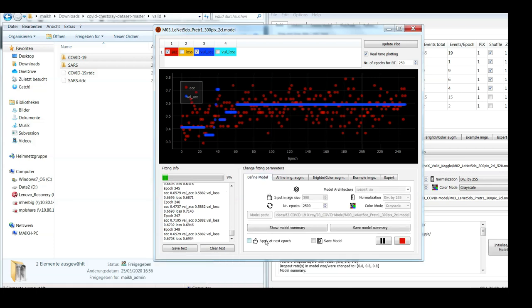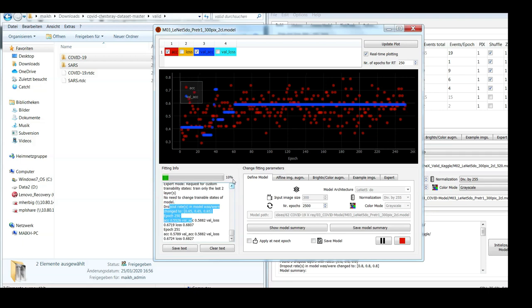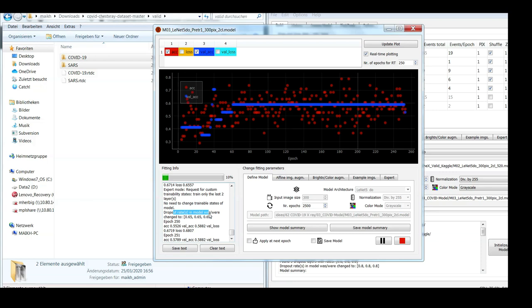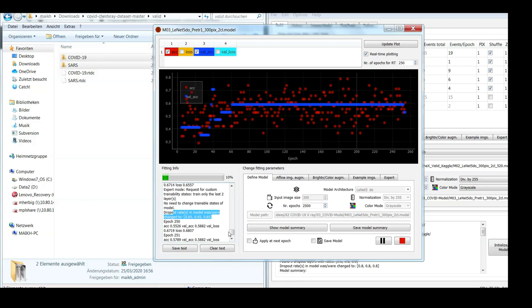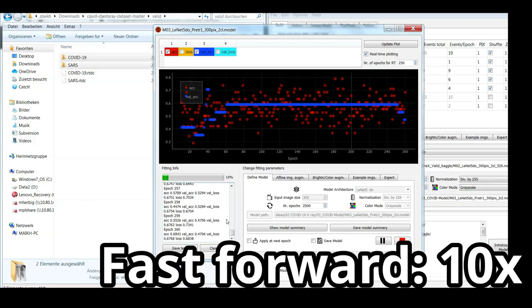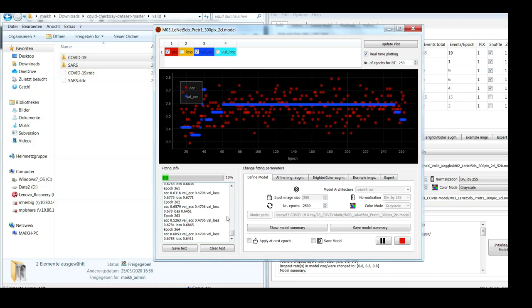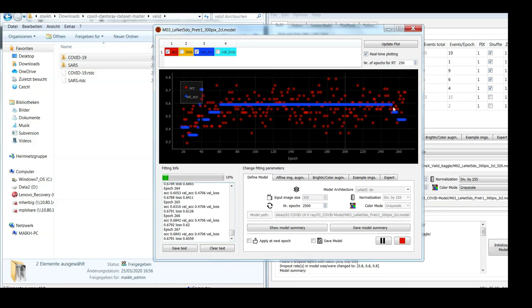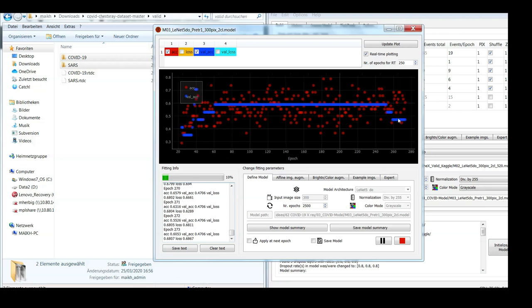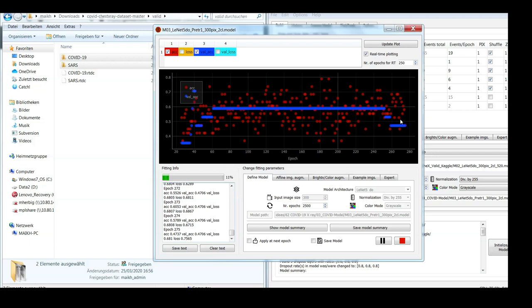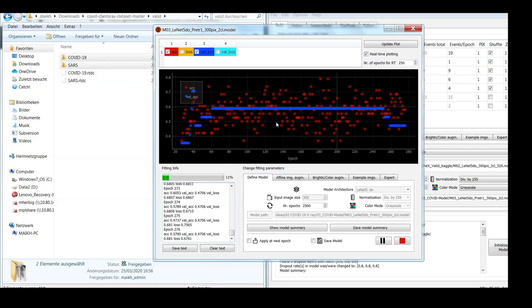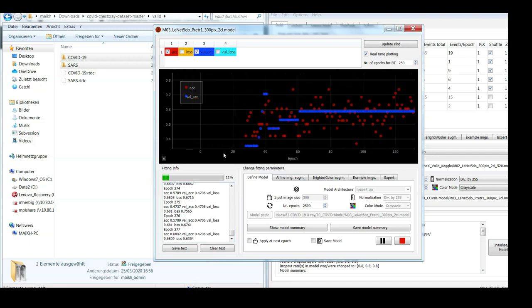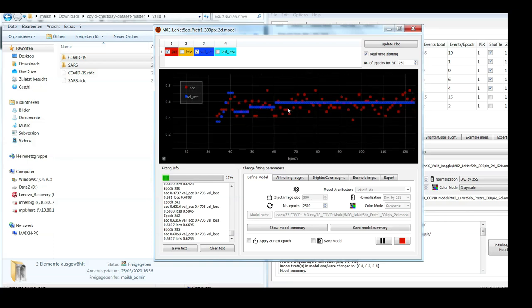And I apply this change at the next epoch, so here you can see that the dropout rates of the model were changed to these values. Okay, so apparently reducing the amount of dropout is not a good idea because it will only cause overfitting, which means the validation accuracy reduces. So in the end, these three models were the best models I was able to obtain with 70% accuracy.